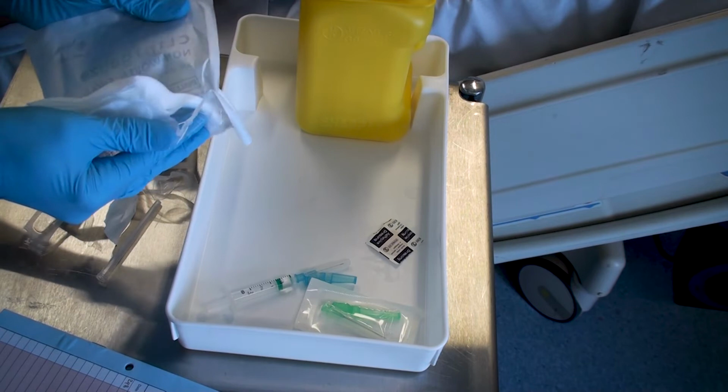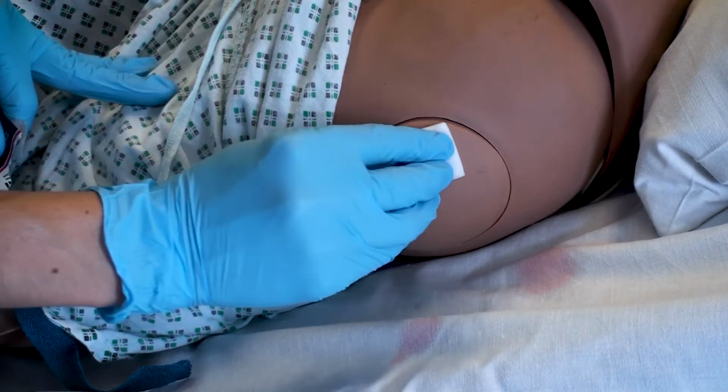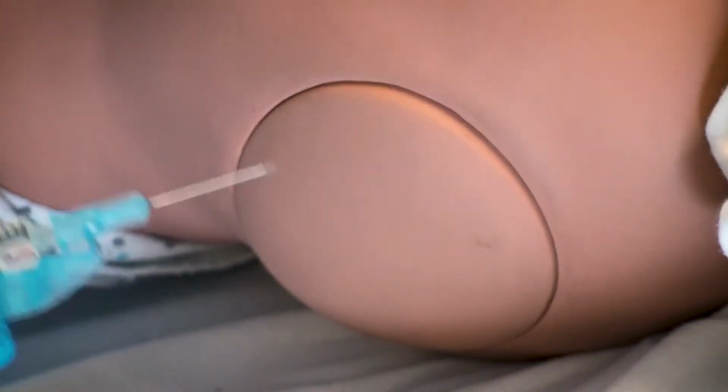In this example, we will be using the upper arm or deltoid muscle. There is no need to cleanse the skin unless the area is not socially clean, but make sure you avoid any areas of infection or lesions. You must then stretch the skin using the Z technique. Stretch it with your non-dominant hand.